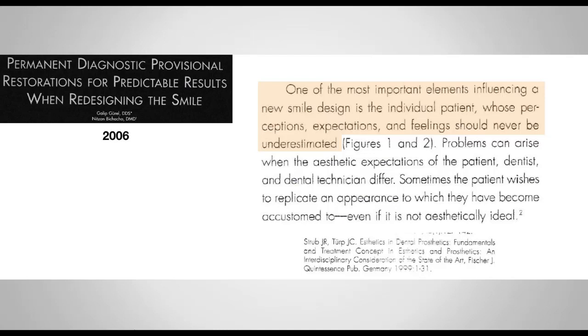It's going to take you to the level where you're not only able to give your patient an idea of what your end goal would be, but most importantly, your patient will be able to take this prototype home because it's bonded to their teeth. They will be able to use it for a couple of weeks, function with the prototype, and have friends, family, or relatives give them some input and let them know whether it seems aesthetically pleasing to their eyes.